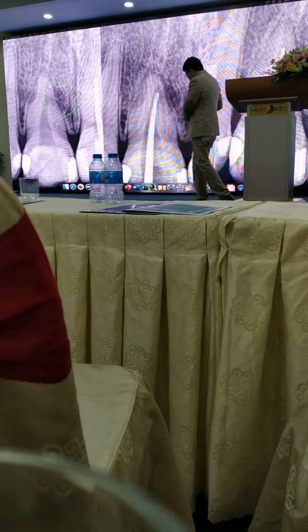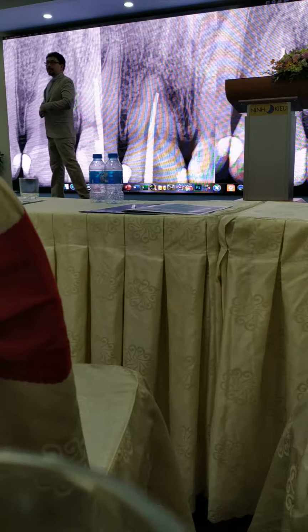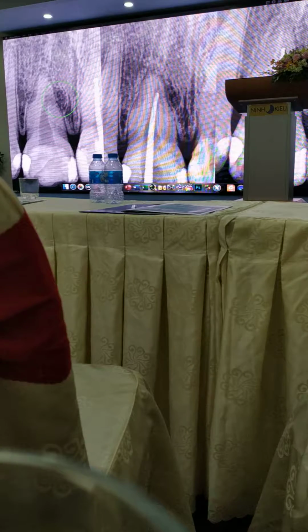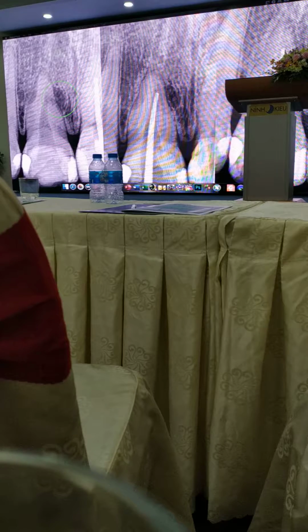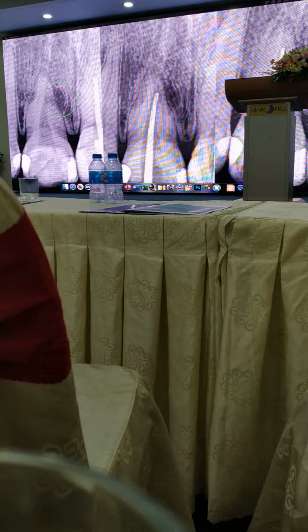Because of the characteristics of these sealers, we can manage some complex cases. Some people think that working in anterior teeth is easy, but it's not that easy. Sometimes we have difficult cases like this.